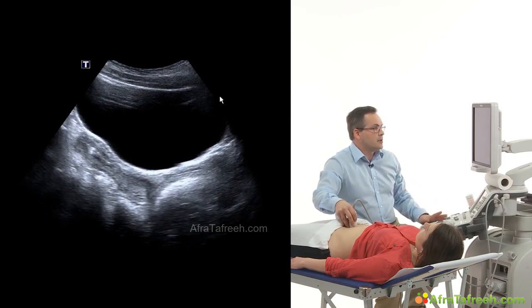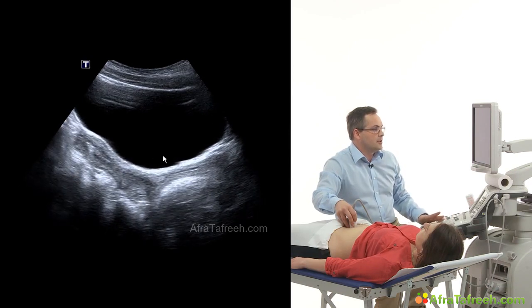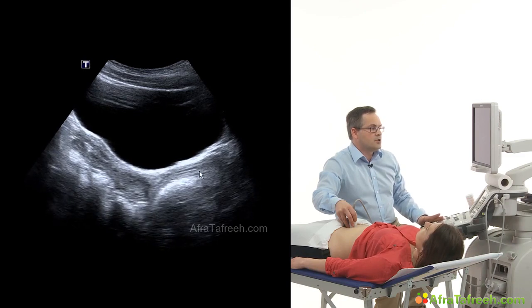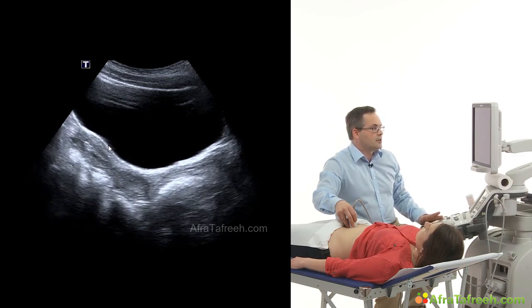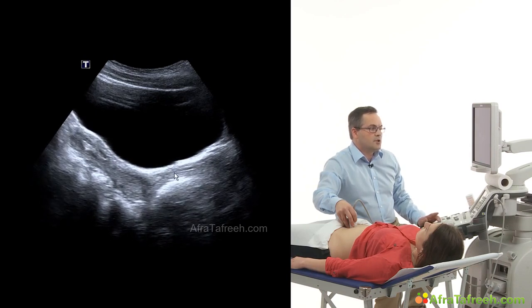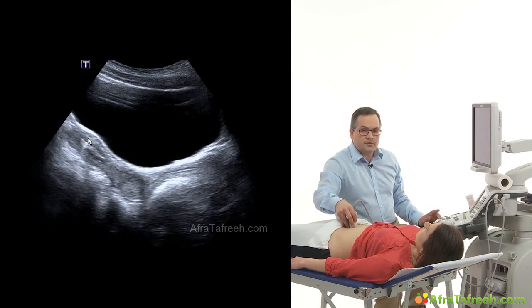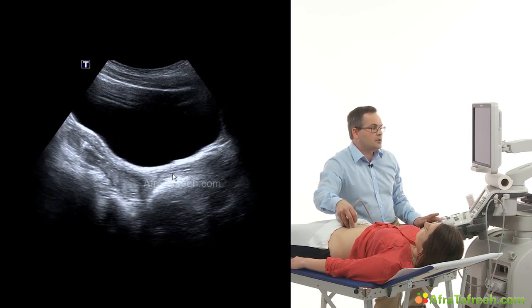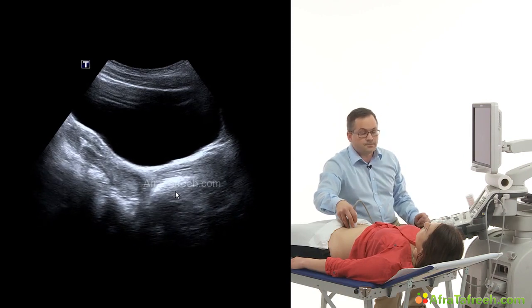We see the bladder over here in the near field on the screen, and dorsal to the bladder the vagina is located, and cranial we see the whole uterus with all its parts, the cervix uteri near to the vagina, and in the most cranial part the fundus uteri in between the corpus of the uterus. Dorsal to the vagina we find gas, which is located in the rectum.